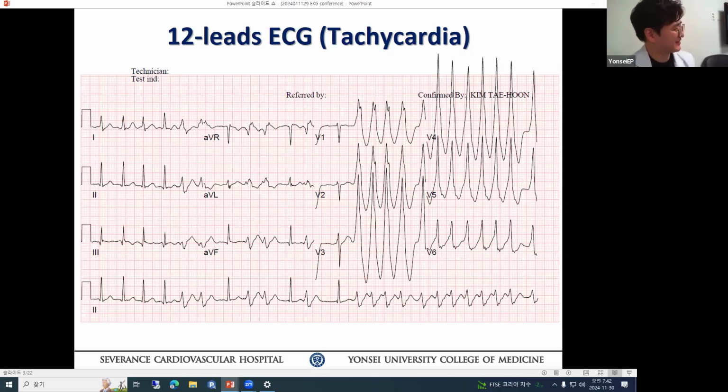아, 저는 네, 케이스를 알고 있어서. Yeah, so if you ask me, when patients present with the sudden cardiac death from WPW, which pathway location is most likely cause of it?